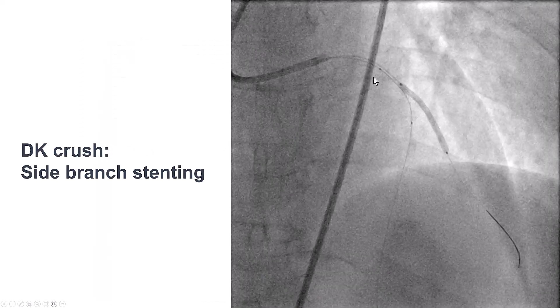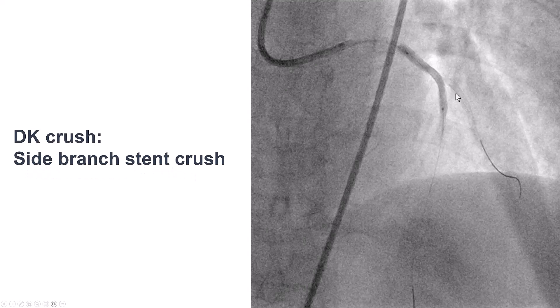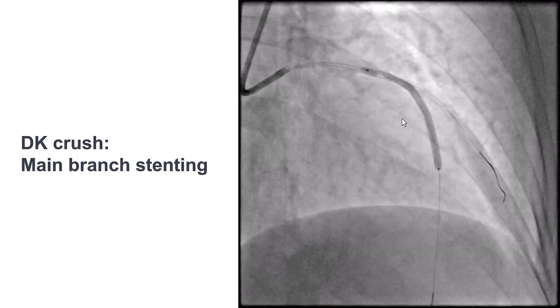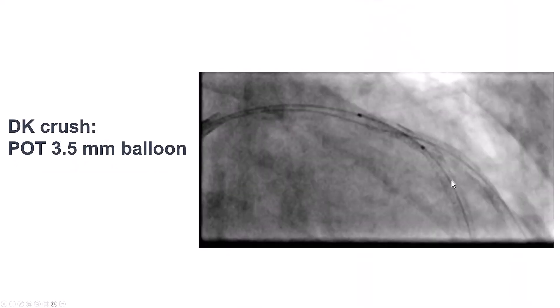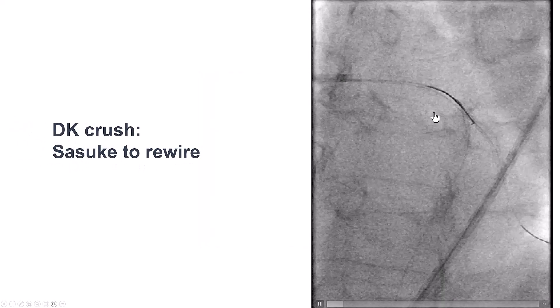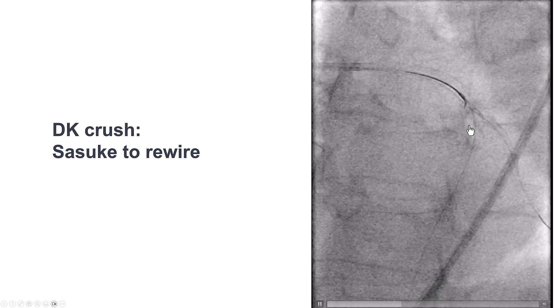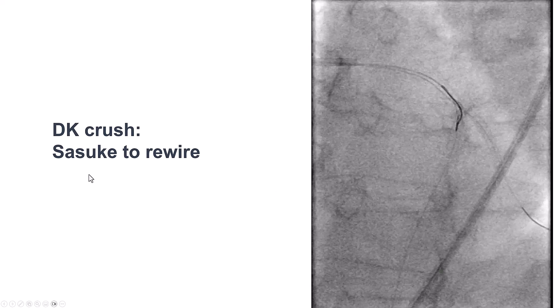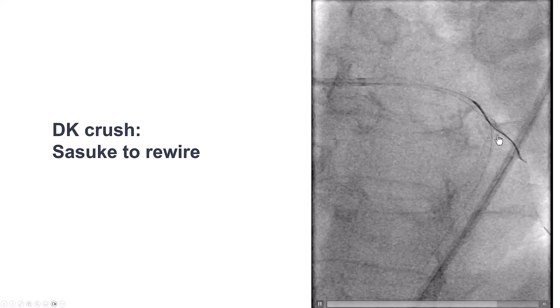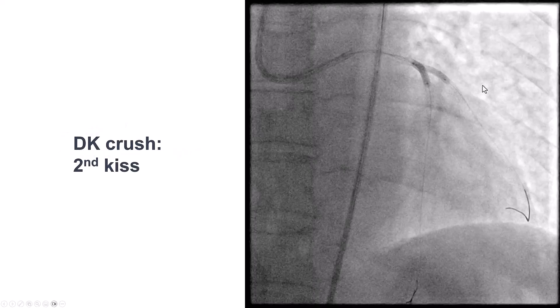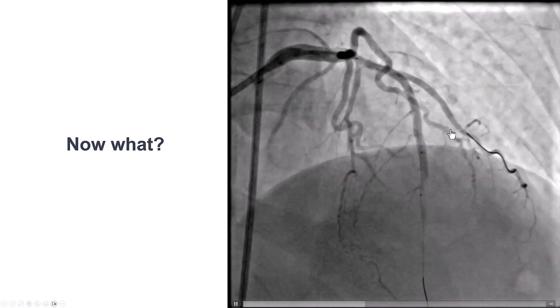We pre-dilated, and given the extensive dissections in both the LAD and the diagonal, we decided to use a two-stent technique — specifically DK-crush — which maintains wire access to the main vessel, the LAD, at all times. We stented into the diagonal, then crushed the stent. We rewired and did the first kissing balloon inflation, then placed the stent in the LAD, followed by proximal optimization. We had some difficulty rewiring in the diagonal branch, but using the Sasuke dual-lumen microcatheter, we were able to advance a guidewire. We performed the second kissing balloon inflation and achieved great flow in the diagonal.